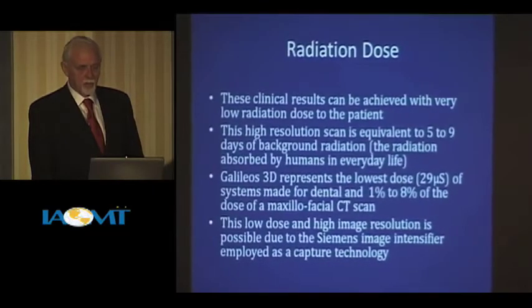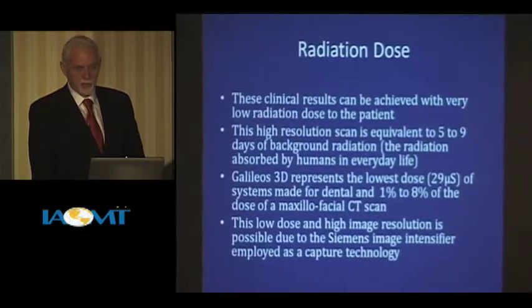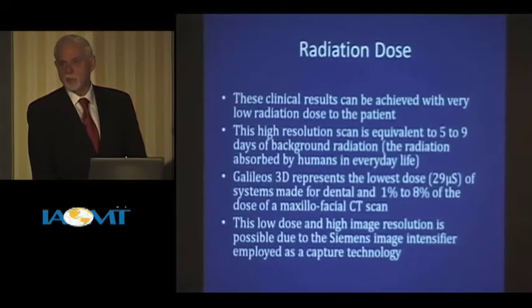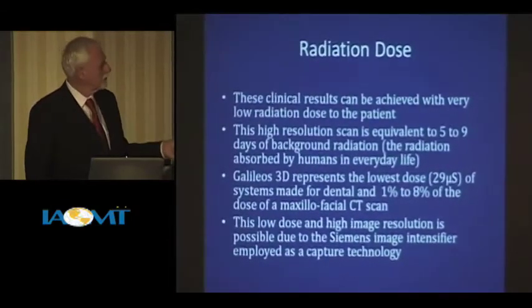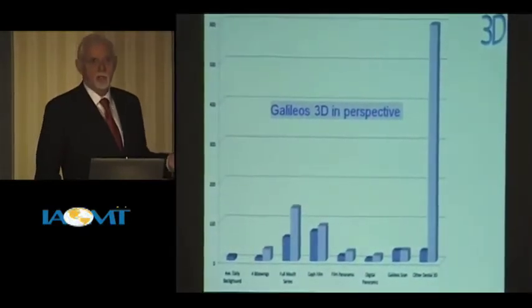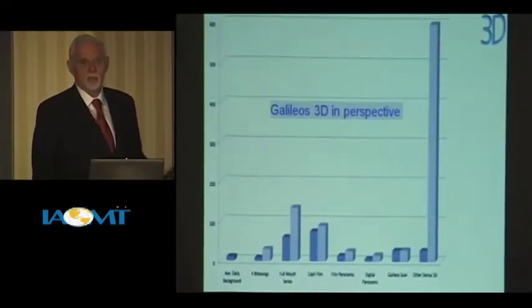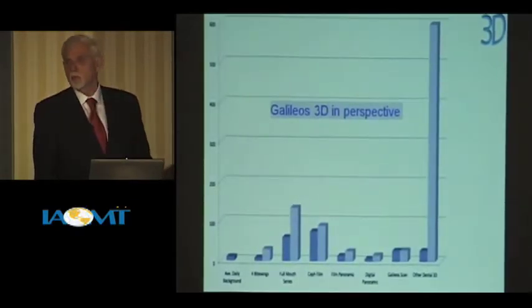scan. The low dose and high image resolution is possible due to the Siemens image intensifier employed as the capture technology. So you can tell that's something from the company. And again, I'm not pushing this brand. I think when you look at what I go through later, if it's something you're interested in, really get out there and do your own research.